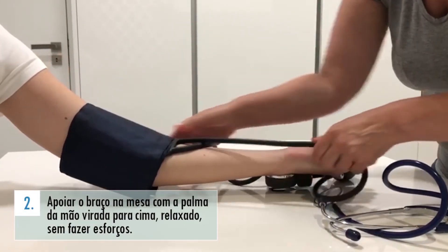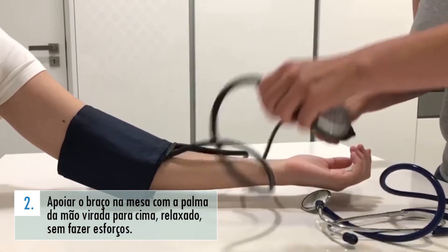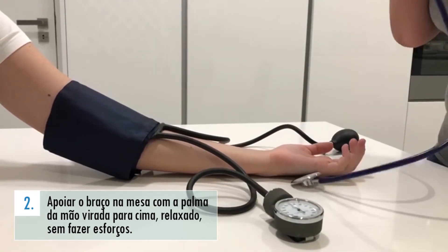Apoie o braço na mesa, ao mesmo nível que o coração, com a palma da mão virada para cima e relaxado, sem fazer esforços para não exercer força sobre o mesmo. A manga não deve ficar apertada.